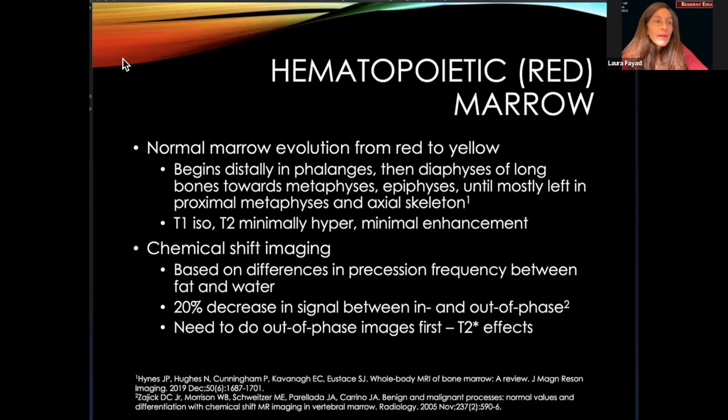Okay, we have a question. How do you check whether out of phase is done first? So I guess first I should explain that. Thank you for asking that. First means with a shorter TE, not literally whether it's done first in the acquisition, that doesn't matter. It's actually whether the TE, and so what Dr. Fayad alluded to is this, it has to be done correctly, right?